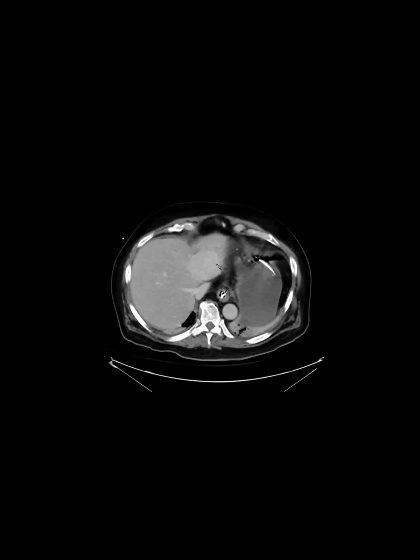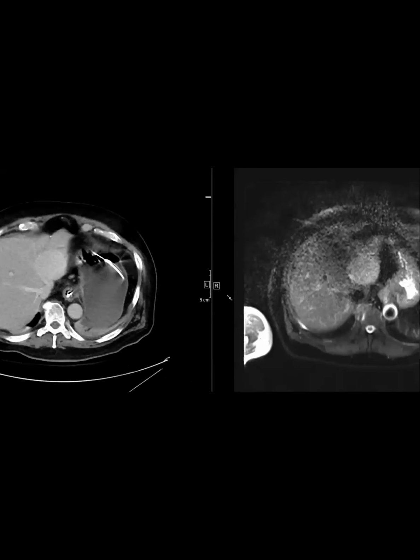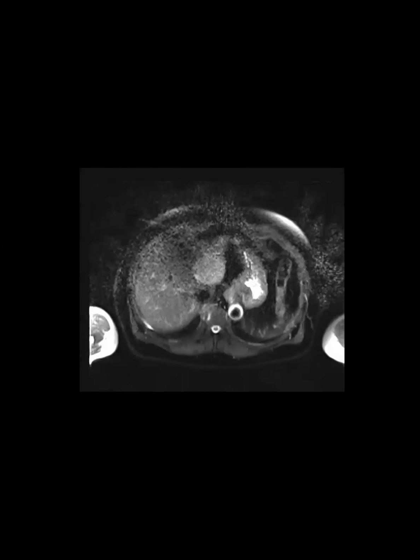Sulfur colloid would also be picked up by FNH, but the EOVIST had excluded the FNH. So we could have done a sulfur colloid, which gets picked up by both liver and splenic tissue, and if this thing was hot, we could have confirmed that this was splenosis. So just a reminder about splenosis.